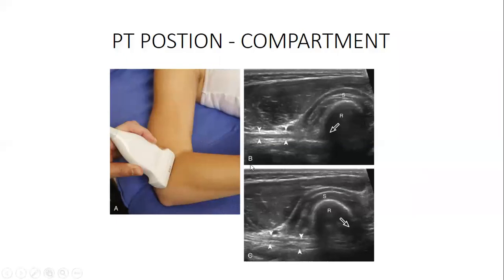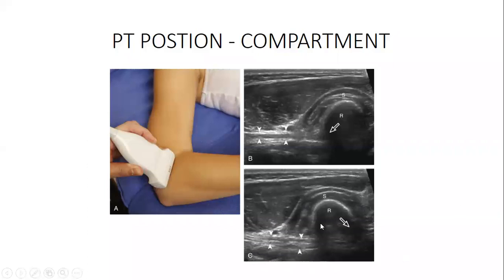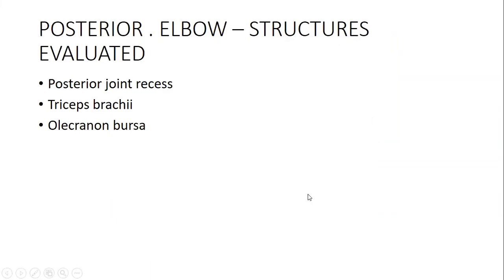We want to check the ligament, and how it is inserting. This is the muscle that we are having here. And then you can also see this tendon. This is the common extensor tendon coming to insert on the lateral epicondyle. So specific things can be checked, and then look at the joint surface, the joint space. Also look at the contour there. Is it regular? Is it irregular? And what is happening there? Do we have anything there?